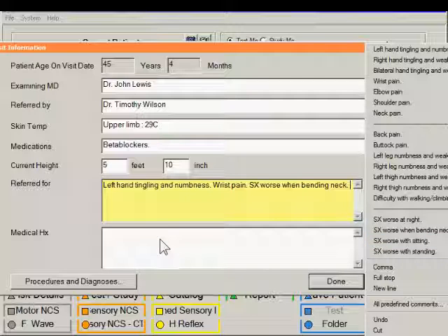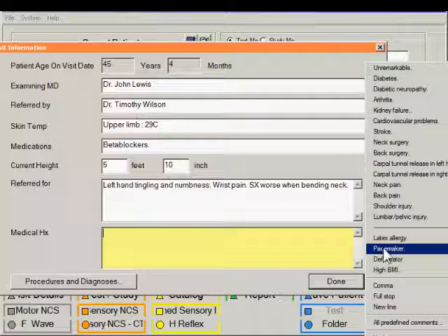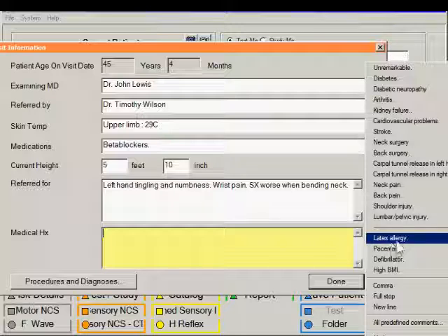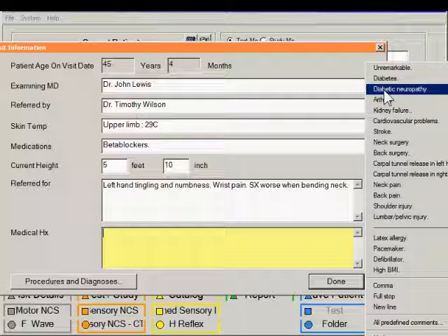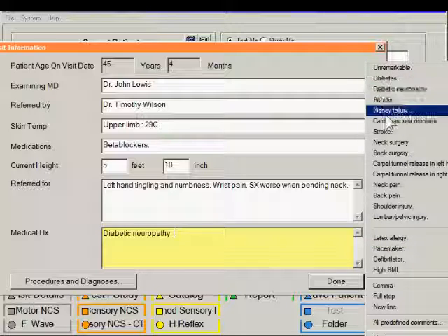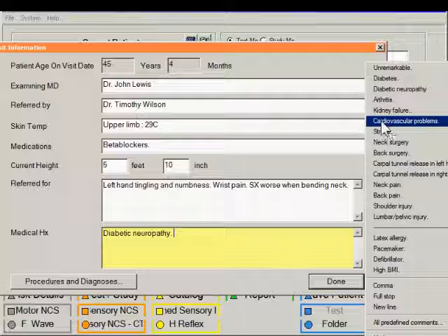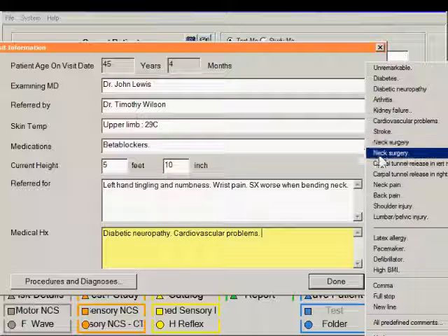And the same is also true for medical history. Again, you can build a short paragraph of information based on a list of possible problems that they might have.